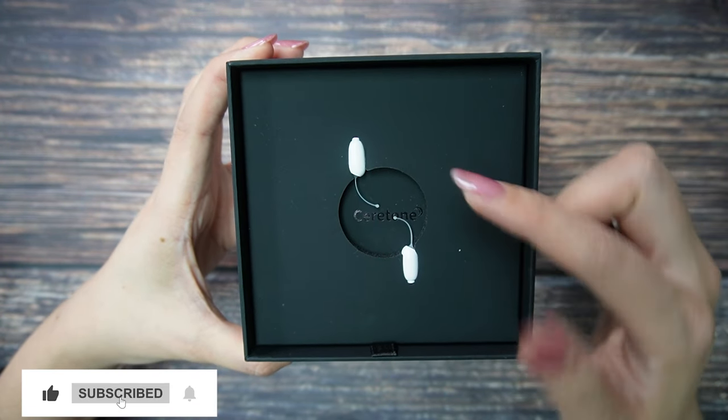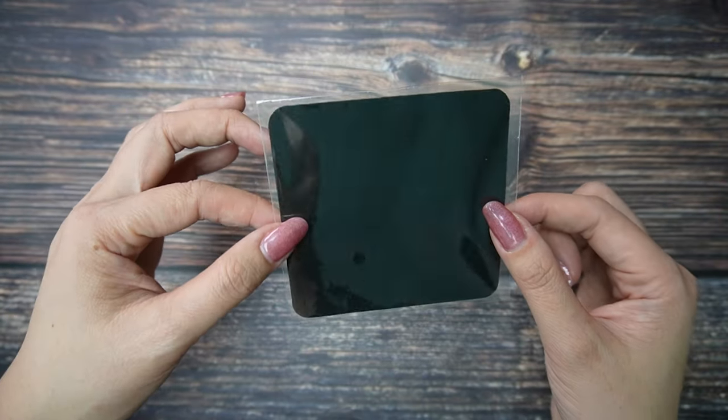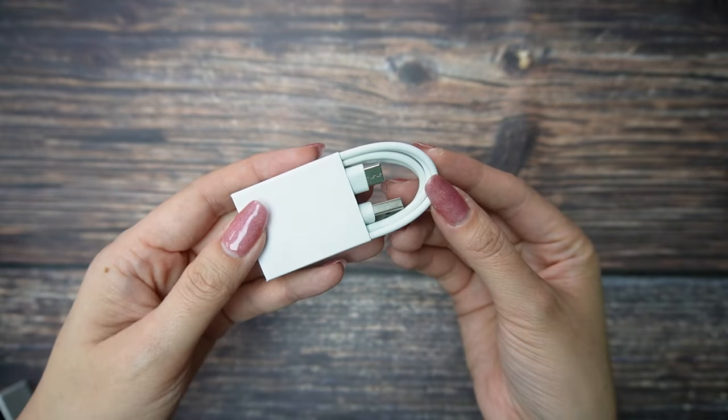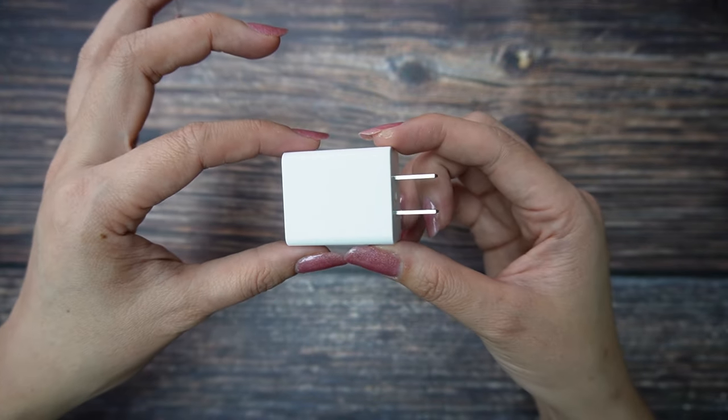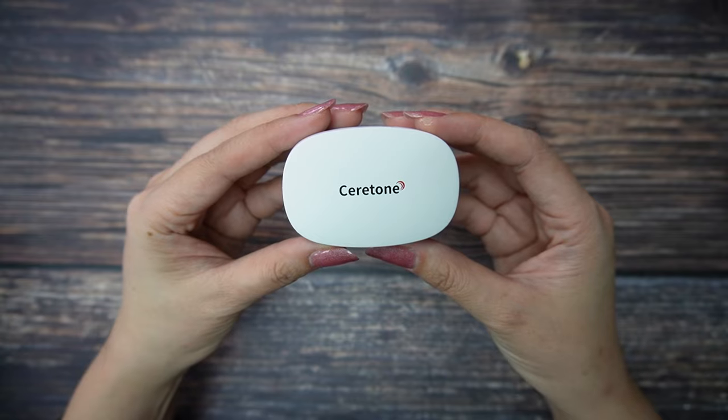They are crazy small — even smaller than my nail. Also included: one cleaning cloth, one cleaning tool, a USB Type-C cable, a USB adapter, ear tips in different sizes, and the charging box.